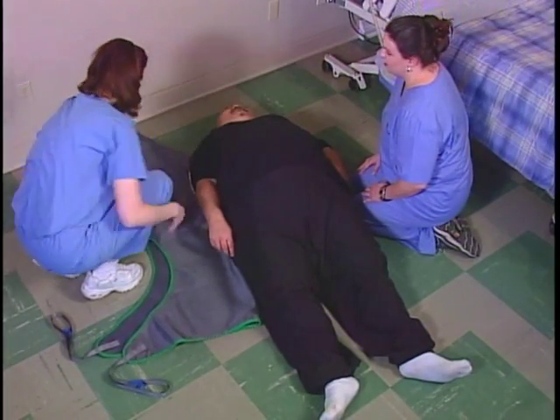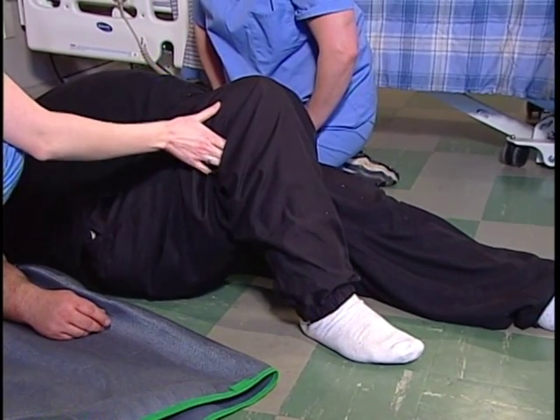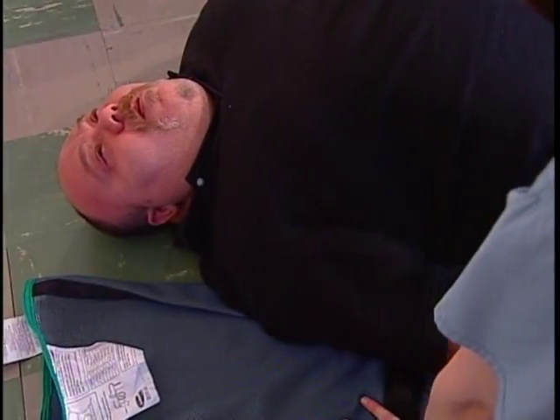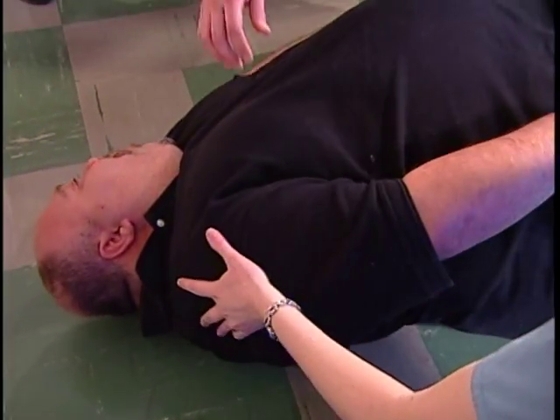Okay. We're going to have you turn on your side. Have the resident elevate one knee until their foot is flat on the floor. And I'll help you by holding your shoulder. Position one hand on the resident's elevated knee and the other hand under the resident's shoulder. All right. Push on the knee and lightly lift their shoulder to roll the resident over on their side.